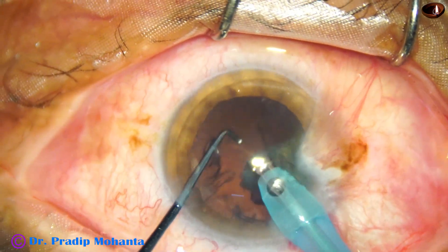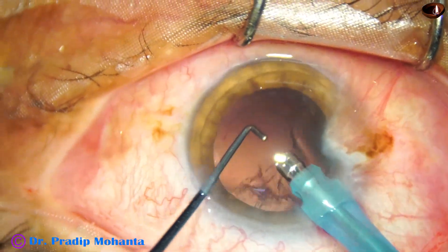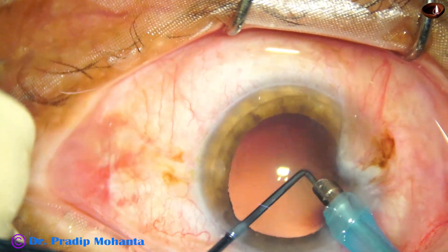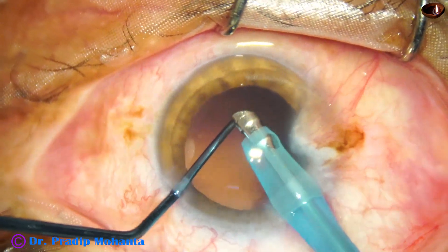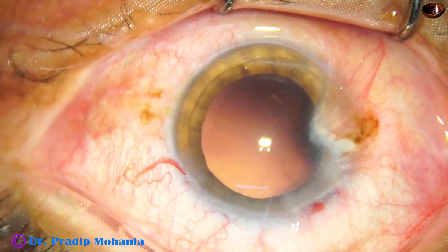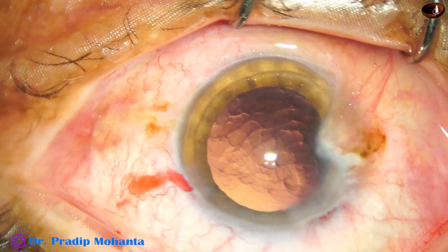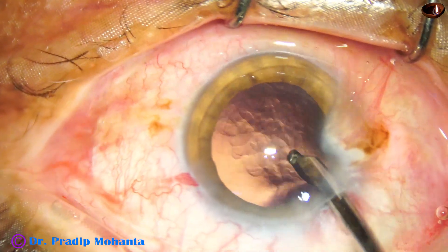We divide the hemi-nucleus with the help of the nucleus sustainer. Now with the handpiece itself we can remove the cortex — it needs some practice, but this is not being recommended; you have to do it at your own risk.